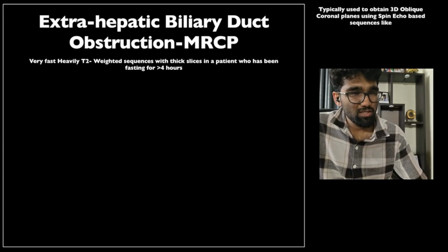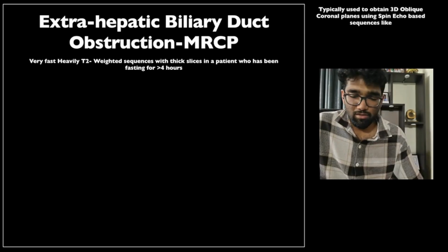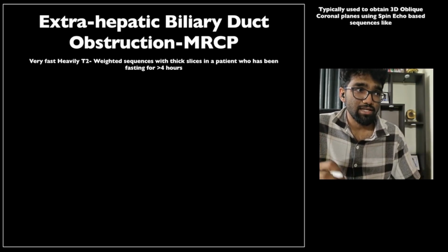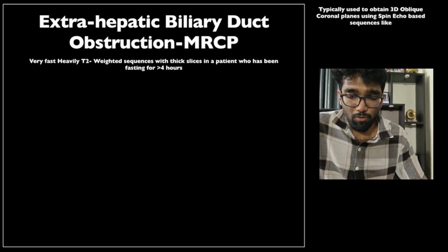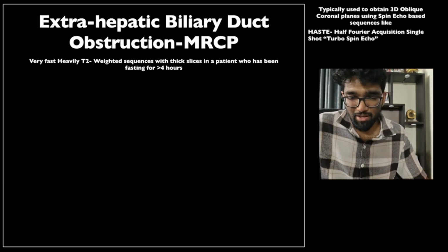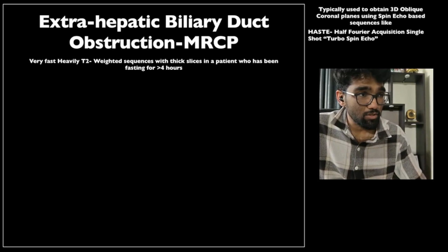A spin echo based sequence is essentially a technique where 180 degree or other refocusing pulses are used to get the dephasing protons of hydrogen back into phase transiently, and then imaging is done as they come back into phase. There are different names given to such techniques, again because our exams are often memory based. I just wanted to mention them for completion's sake.